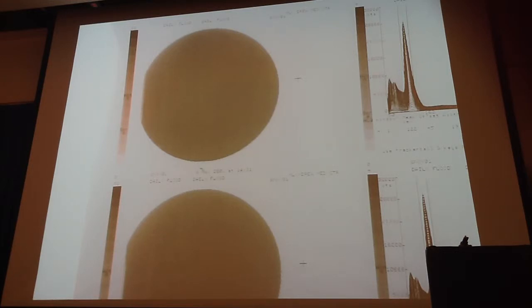The other one is a 57 cobalt source. The sheet. Yeah. So a flood source is the cobalt phantom. The flood phantom is the one that has the water filled that you mix technetium in. And the reason why some people still use the technetium flood phantom is because it's cheaper. Technetium is only about 17 cents a millicurie. You don't put that much in there. I think some people put it in a range maybe 3 to 5 millicuries.